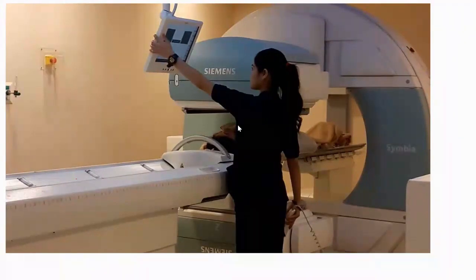So that's the point. So what is the idea, Dr. Hani? What happens is that you don't really adhere to the guidelines. For example, you have a patient who is fatty and their dose is low and the image is not good. So if you want to get a good image, what do you do? The scan time or dose adjustment is indeed happening daily, as I mentioned. There is no specific protocol, but you work on these parameters and modify them because the situation is truly variable.